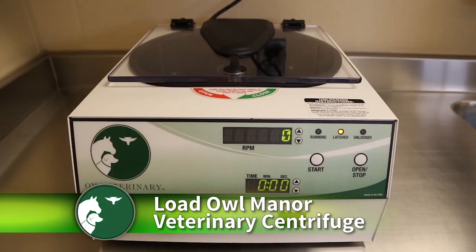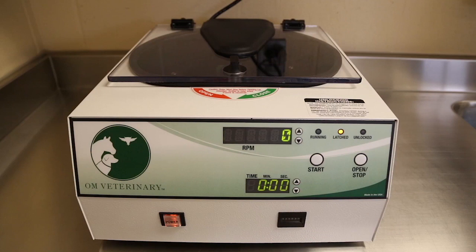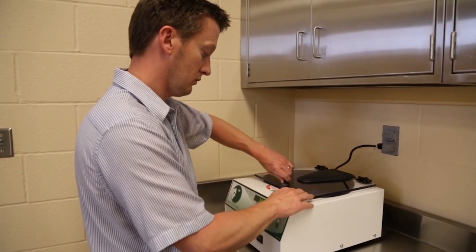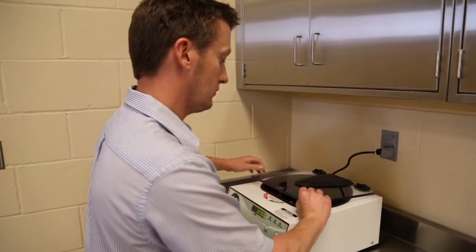At the time of the first centrifuge spin, ensure the centrifuge is on a secure and flat surface, plugged in, and the power on. Press the open button. While gently pushing down, twist the latch on the lid counterclockwise to open.